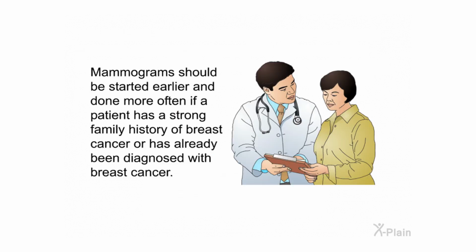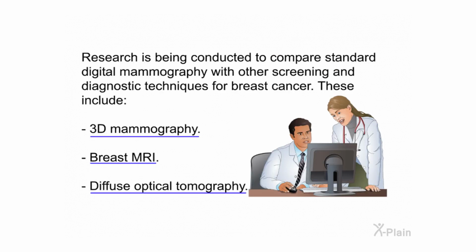Mammograms should be started earlier and done more often if a patient has a strong family history of breast cancer or has already been diagnosed with breast cancer. Research is being conducted to compare standard digital mammography with other screening and diagnostic techniques for breast cancer. These include 3D mammography, breast MRI, diffuse optical tomography.